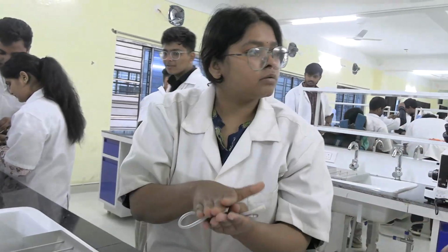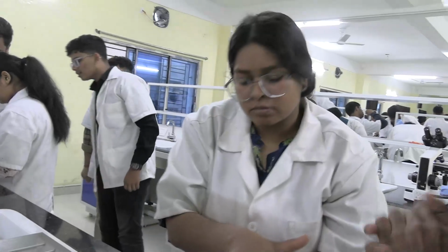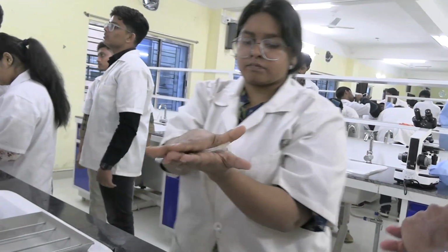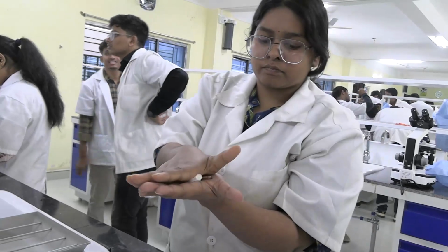You have done the RBC count, isn't it? Okay, so I will show you. Do it. First do the mixing, 2 to 3 minutes, okay?